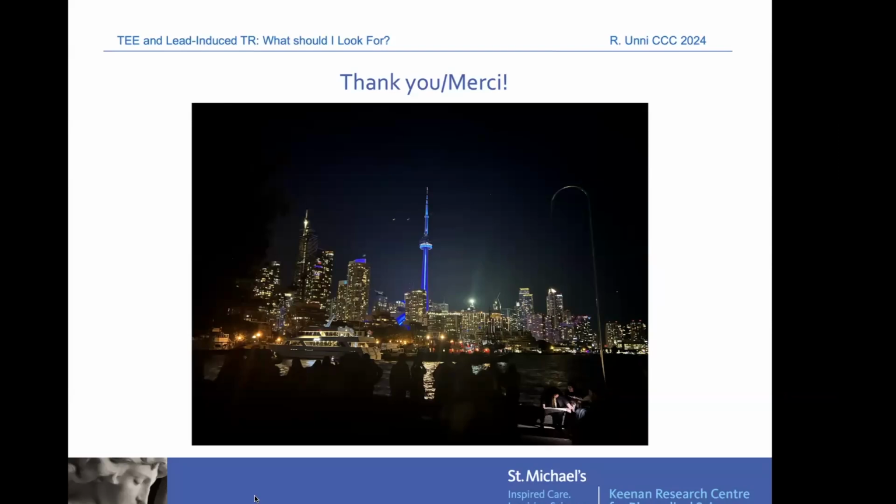So how is the lead in relationship with the leaflet? Is it impinging the leaflets, or is it affecting the subvalvular structure? So lots of panning and sweeping to get these images. I'll shout out to Matthew, one of our new additions to our Echo Lab, who did that.